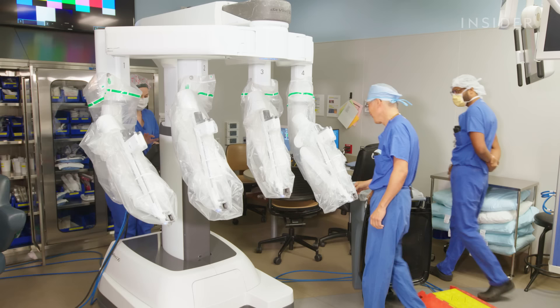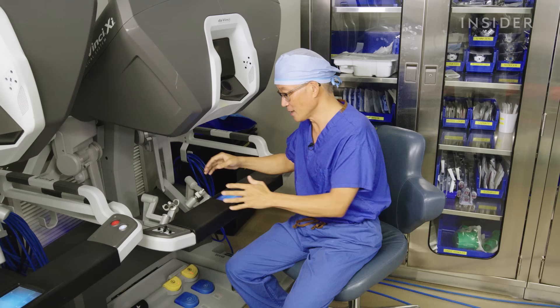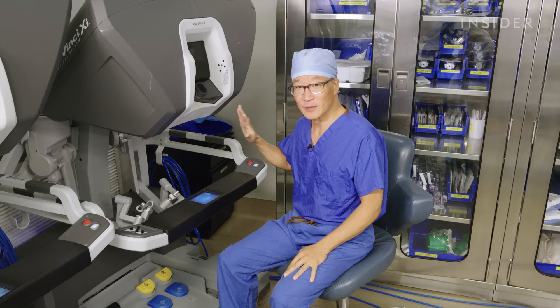This is the robot room, which was specifically designed to house the robot. The use of the robot is to allow us to get into different body parts minimally invasively. Another advantage is that we all have tremors — the further we are away and the longer instrument we're using, the greater the tremor that's transmitted to the tip of the instrument. The robot takes all of that away.